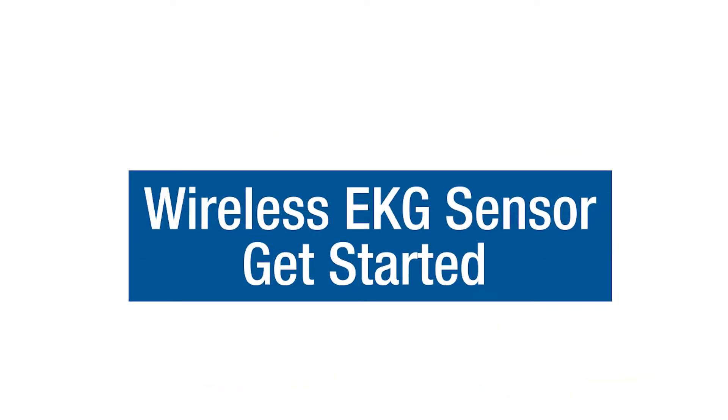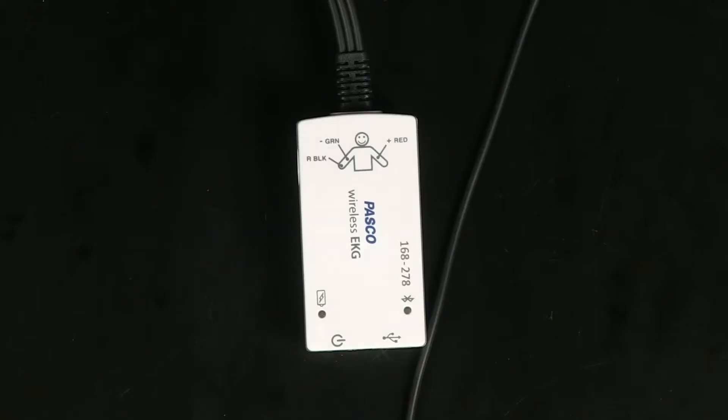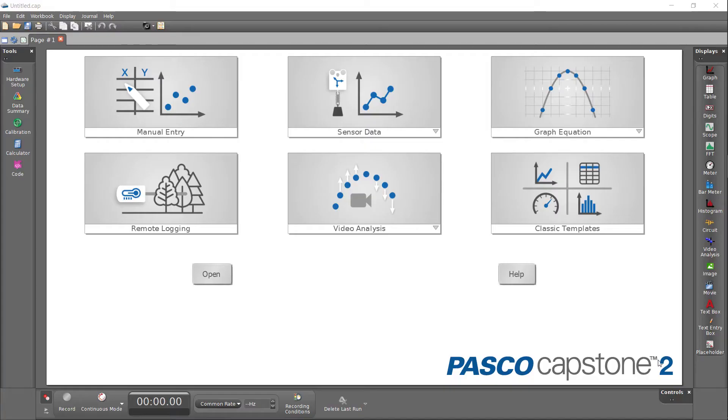Today we're going to look at how to use PASCO's wireless EKG sensor to study the electrical activity of a person's heartbeat. The heart's pacemaker generates an electrical signal with each heartbeat. EKG, also called ECG, is an abbreviation for electrocardiogram, which is the visualization of that electrical signal as it travels from the pacemaker to the upper and lower heart chambers. The wireless EKG sensor uses electrode patches to pick up the heart's electrical signals and transmit them to SparkView or PASCO Capstone software.